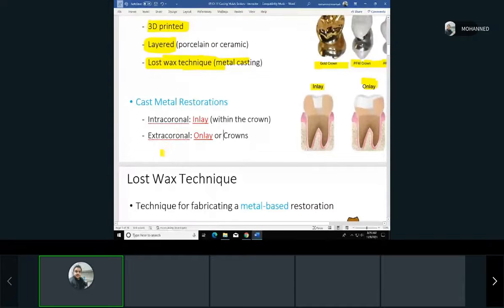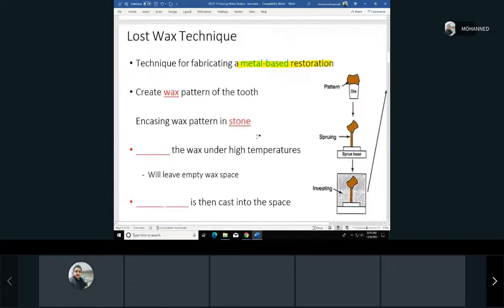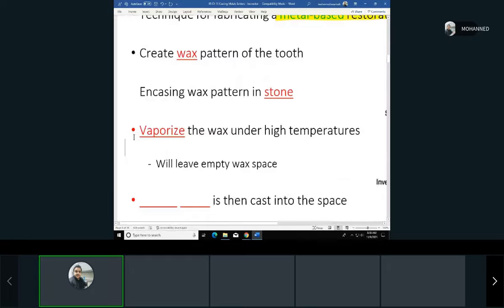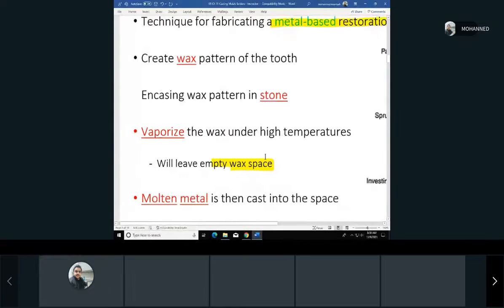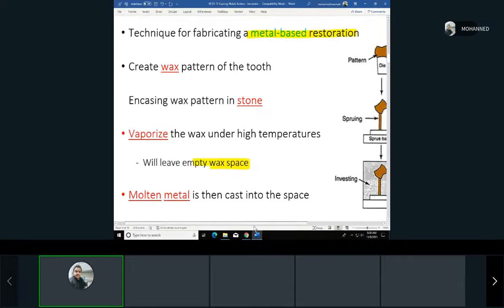Anyway, if we want to summarize the lost wax technique, it's a technique to fabricate metal-based restorations. We first create a wax pattern of the tooth. We encase it in plaster or stone. And then we vaporize, evaporate, burn out the wax, where we will have an empty space left, and then metal is placed into the space. If you see the pictures next to it, again, that makes it just simpler.